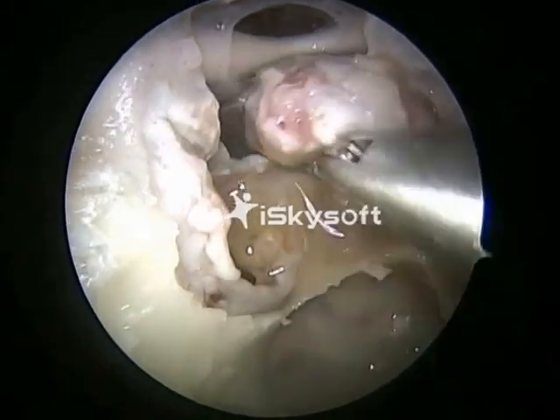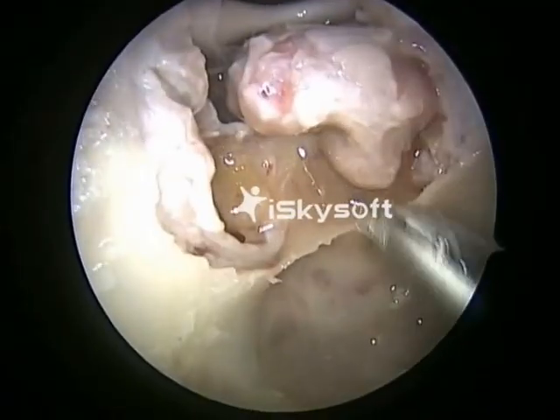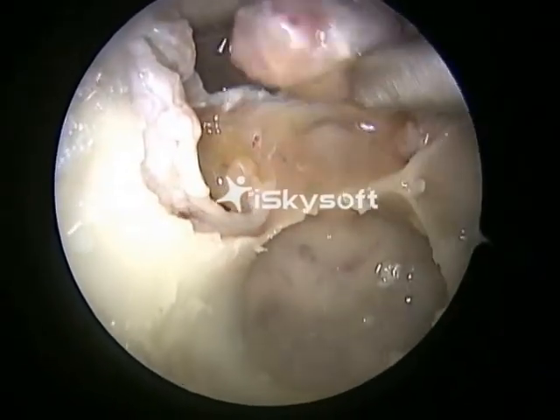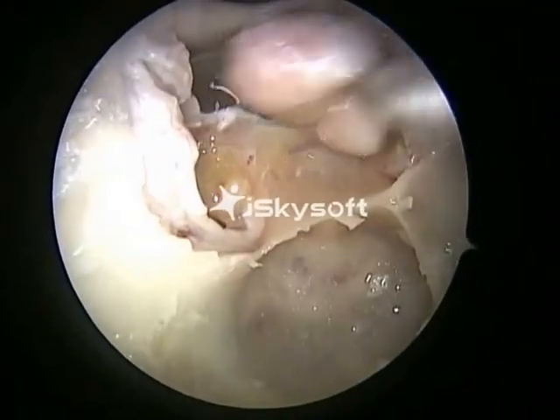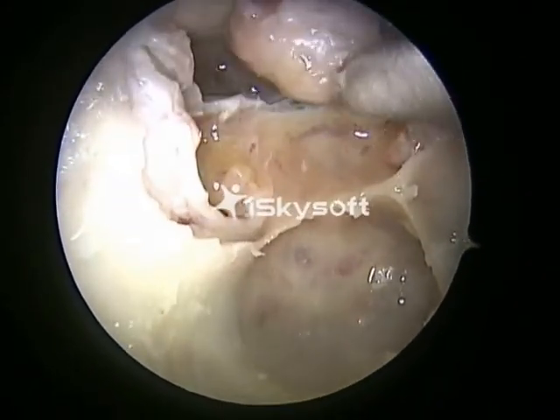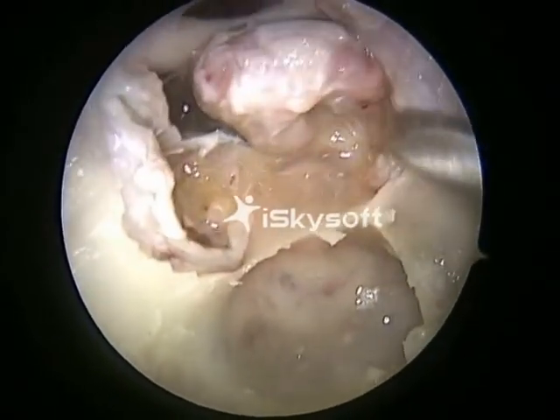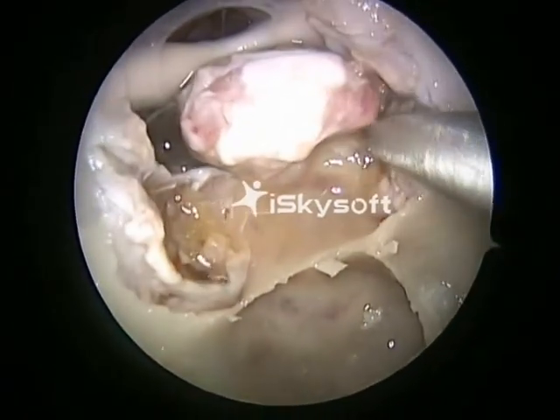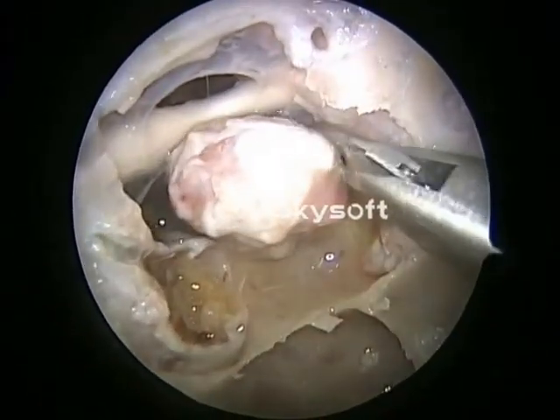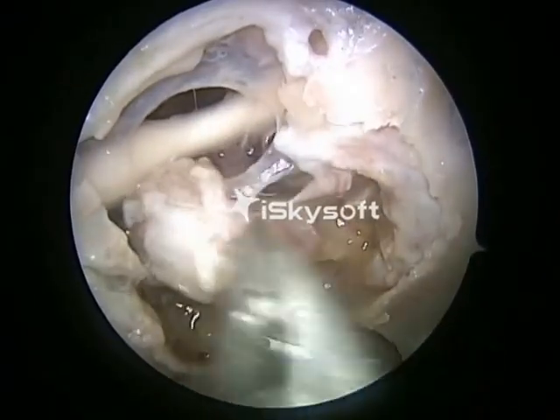That's again the dural attachment, which is being cut. At the end of this procedure, the pituitary gland will be suspended only by its stalk and the superior hypophyseal artery. It will be rotated above and fibrin glue will be used for it to stay there.